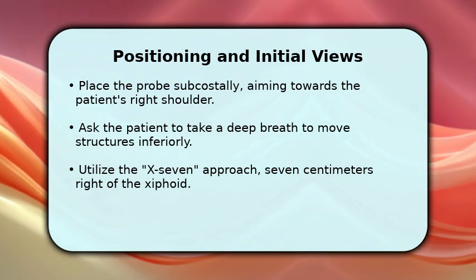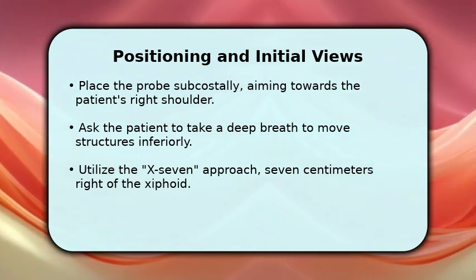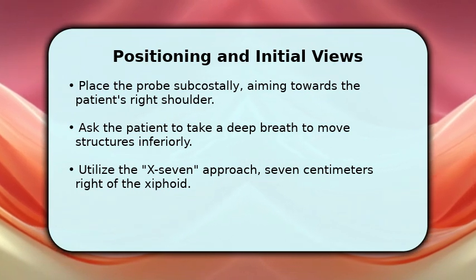Another effective method is the X7 approach, placing the probe about 7 centimeters to the right of the xiphoid process.